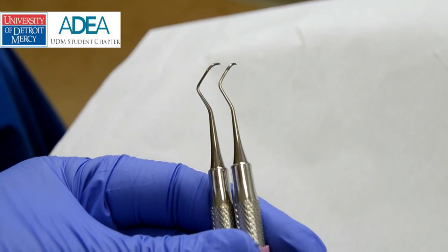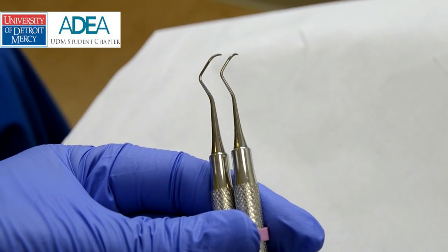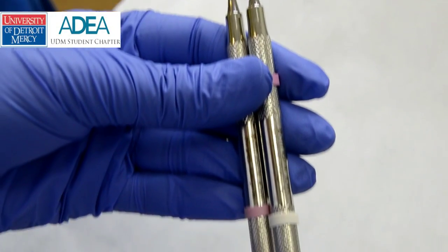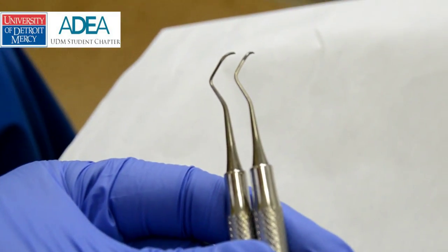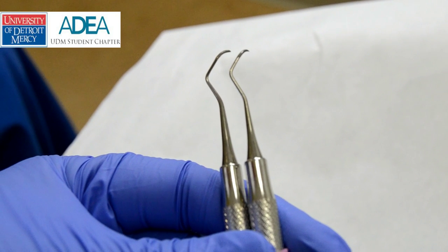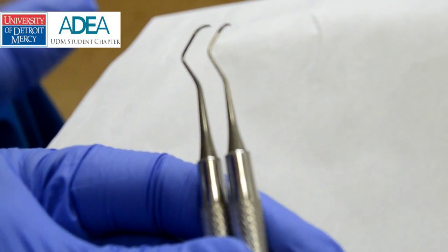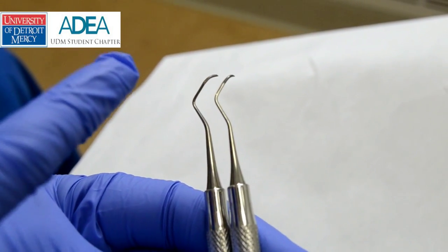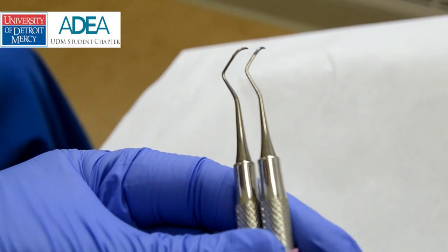What I want to go over is the Barnhart 5-6. The top instrument here is the Columbia 13-14 and the bottom one is the Barnhart 5-6. They're both universal curettes — they both can be used anywhere in the mouth — but the only big difference is the length of the terminal shank. Basically, the longer the terminal shank, the more likely this is to go more subgingival.